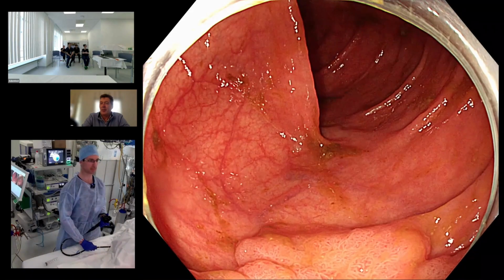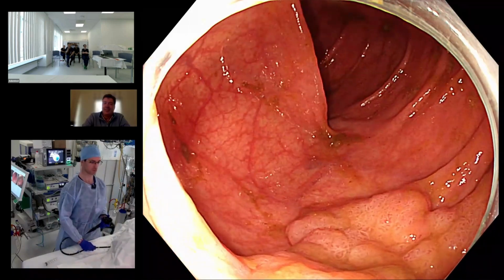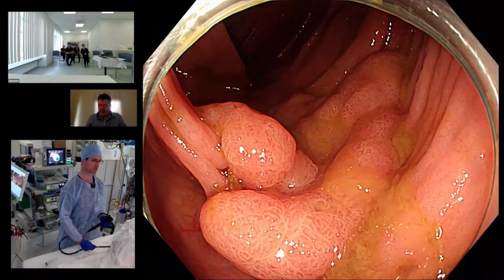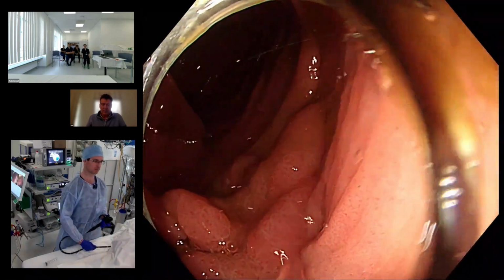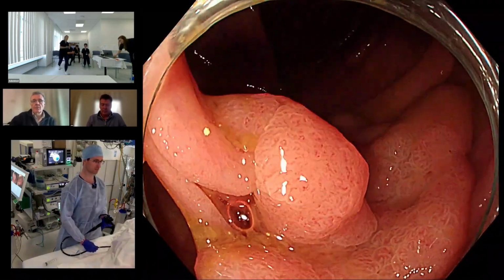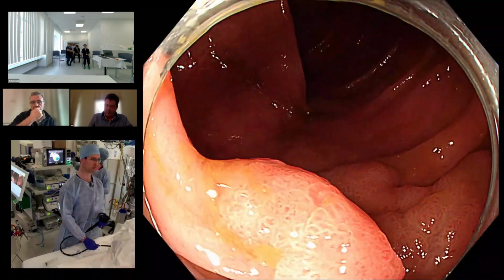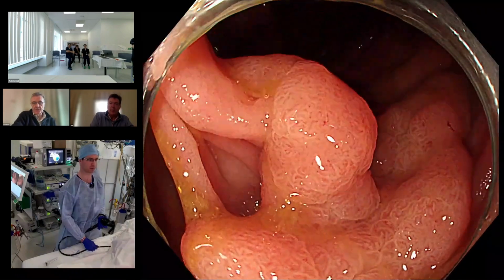Okay, so in this segment, we have found 3 polyps. This is the most distal one that comes through a fold, touches a second one, and is located in the distal/mid transverse. Has a Paris of 2A, probably has also a component that is more than 2.5, so maybe 2A1S.